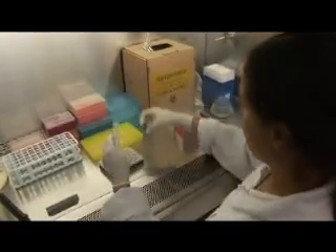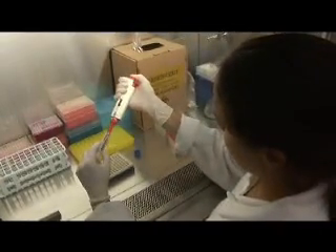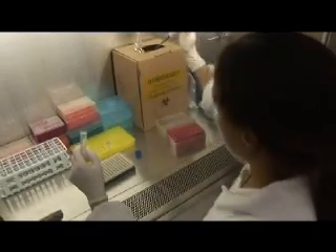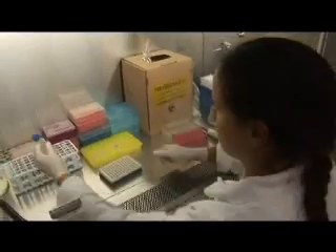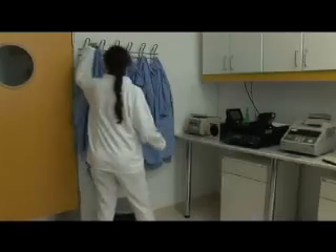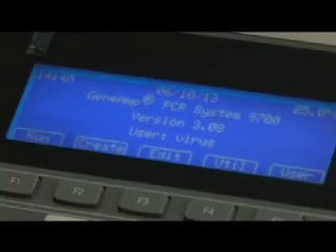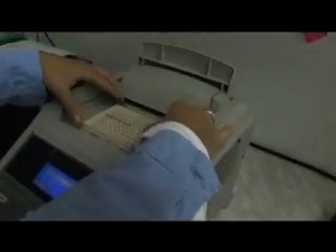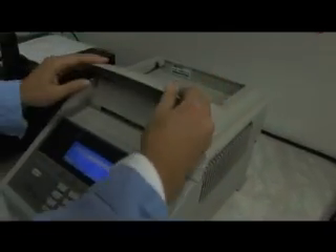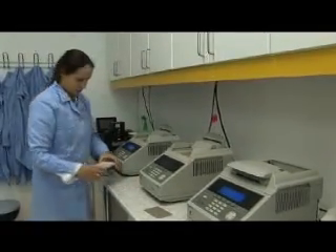A PCR-negative control, which is DNA-free water, should also be prepared. Please check the recommended PCR plate design in the manual. Close the tubes and place them in the thermocycler, which should be programmed in advance. The thermocycler parameters are carefully optimized. If you use a thermocycler other than GeneAmp PCR System 9700, it is recommended that an experiment be carried out with a series of diluted positive controls.